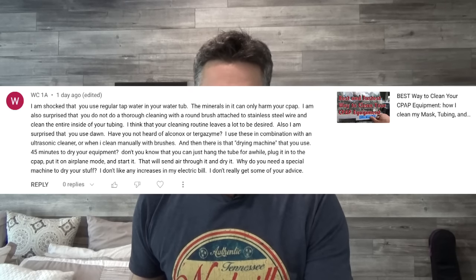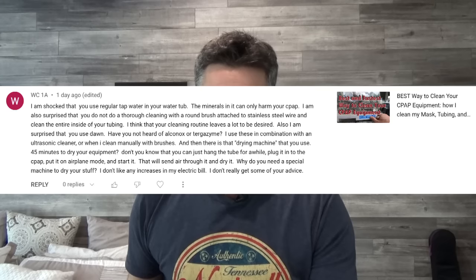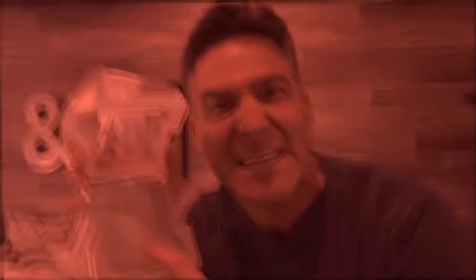And I straight up got called out. WC1A says: 'I am shocked that you use regular tap water in your water tub. The minerals in it can only harm your CPAP.' Are you talking about this? You see that? Does that disgust you? Does it sicken you? Yeah, I'm not really worried about that stuff. These minerals, they'll come right out with a little bit of white vinegar.